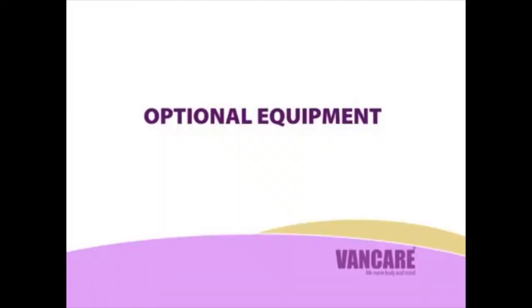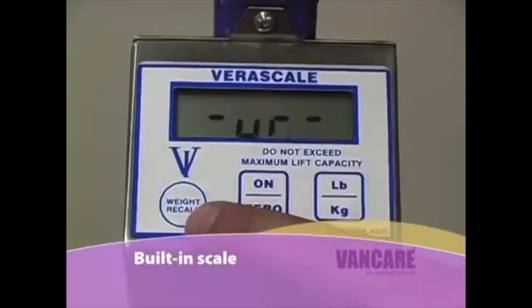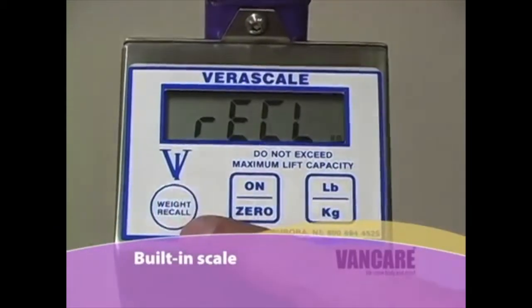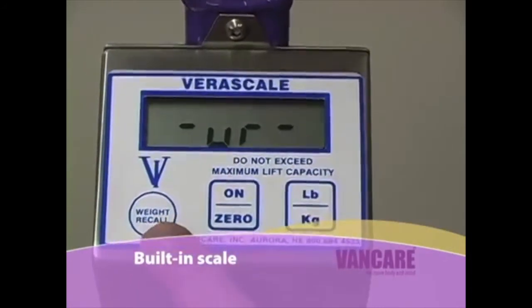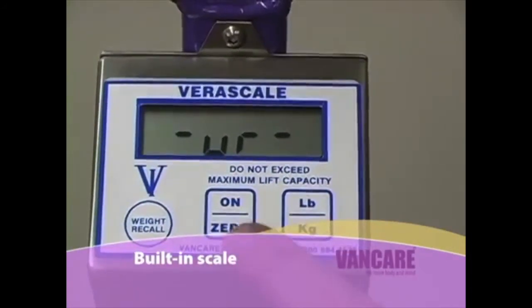Optional equipment. VanCare offers a built-in scale with all of its series 2 floor lift models. Read your operations manual for details on how to operate the digital scale.